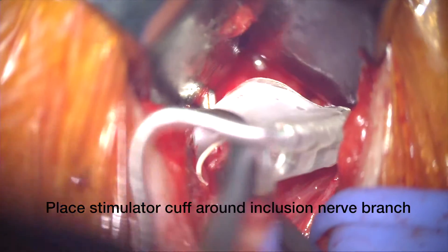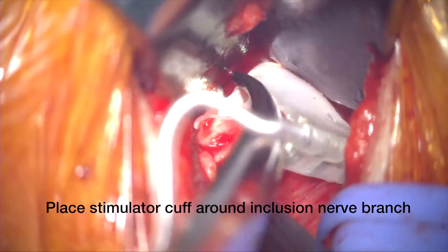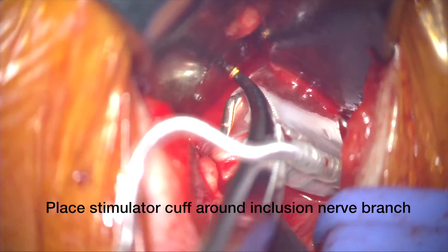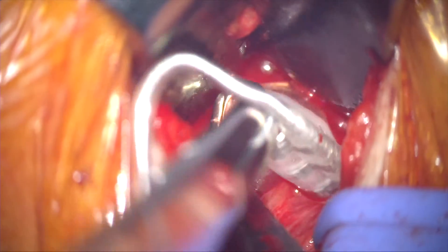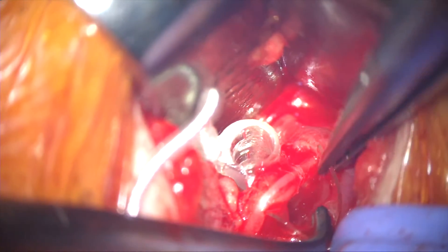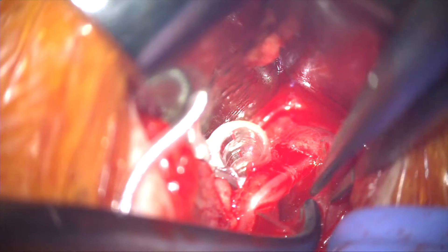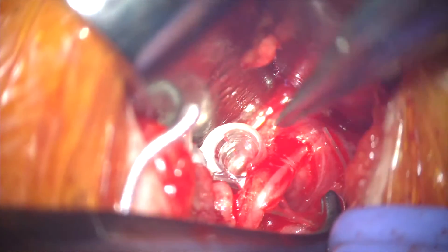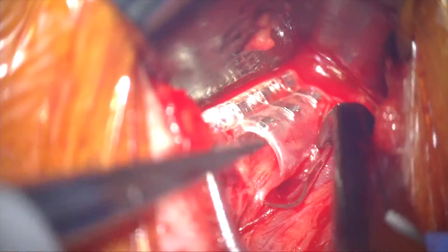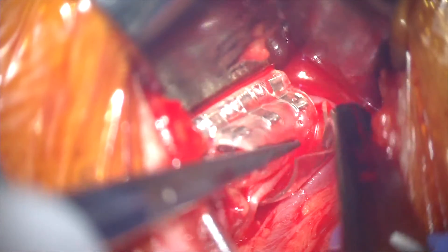This is a tricky part of the operation. We use a Jacobson clamp on the flexible cuff of the stimulation lead and with our McCabe we reach underneath the nerve to grab onto that cuff and then as gently as possible bring that cuff around the nerve. There is a looser and a stiffer portion of the cuff — the stiffer part needs to be around the nerve — and it takes some doing sometimes to get this around, but eventually you can see that we're able to accomplish getting that cuff to surround the inclusion branches.